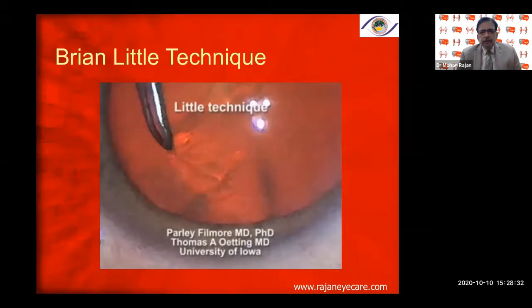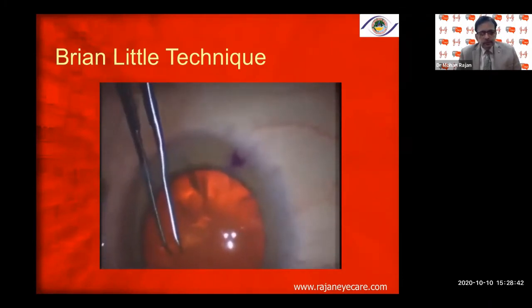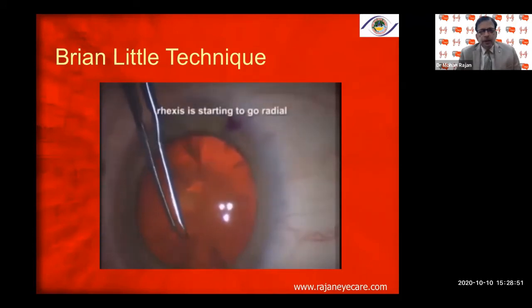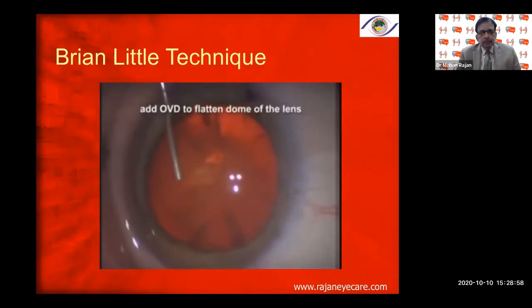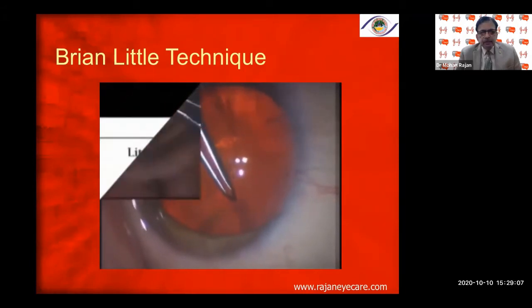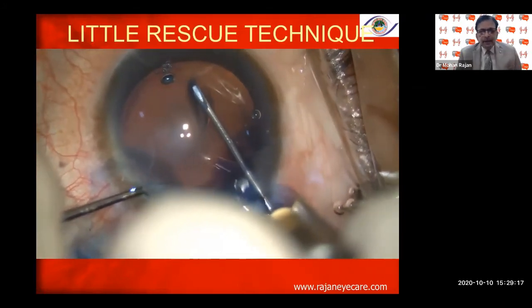This is a case done by Dr. Parley Fillmore, one of our great residents. He is doing a rhexis and everything is going okay at first, but as he rounds the corner he begins to go radial. When the rhexis goes radial, the most common spot — normally there is a tendency to pull in the same direction, which makes it more radial. Adding some viscoelastic is the best first step, but pulling the rhexis in the same direction pushed it out even more, making it more radial.